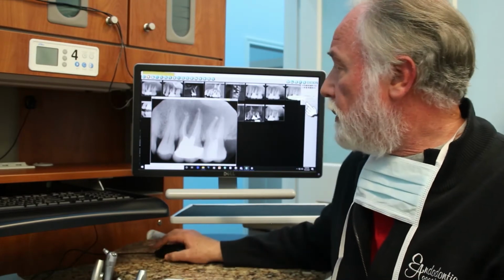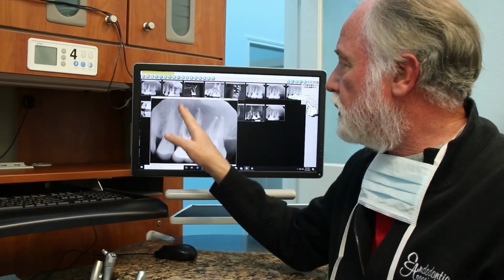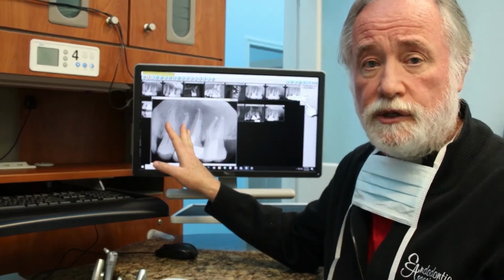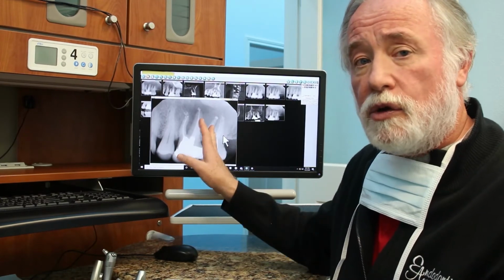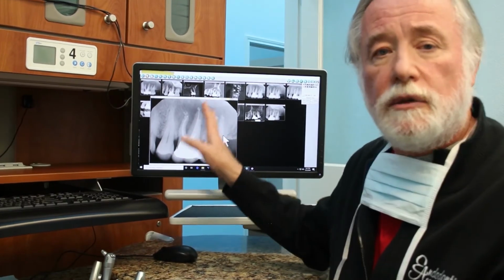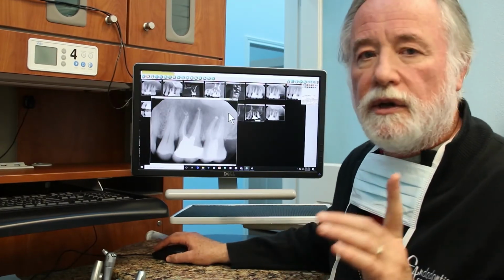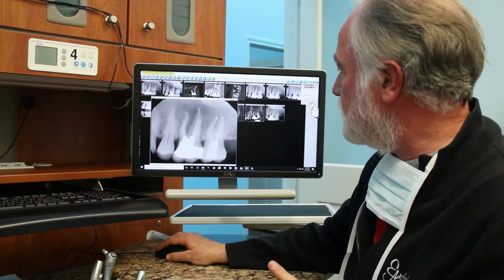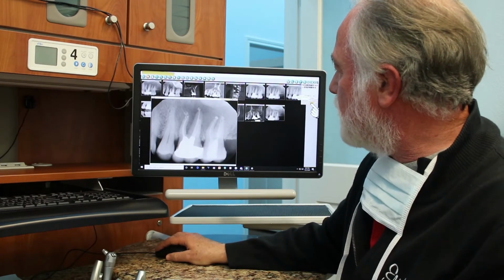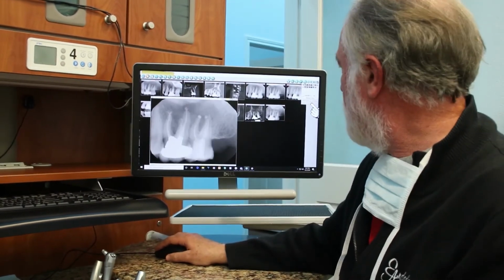So recall now, we talked about how root canals get reinfected. So this root canal that was originally done was redone. And again, GentleWave cleaning it out. And then the tooth in the back, also dead or necrotic, so a root canal was done on that one. You see a slight overextension of some of the filling material here, but the body gets along with that one fine in this particular case. So here we go. So this was after we did the redo of the root canals.